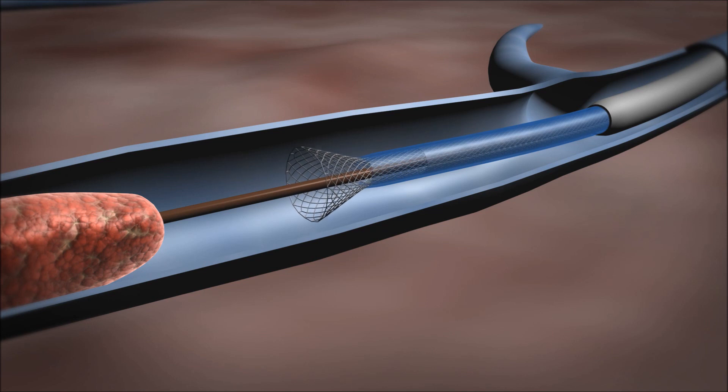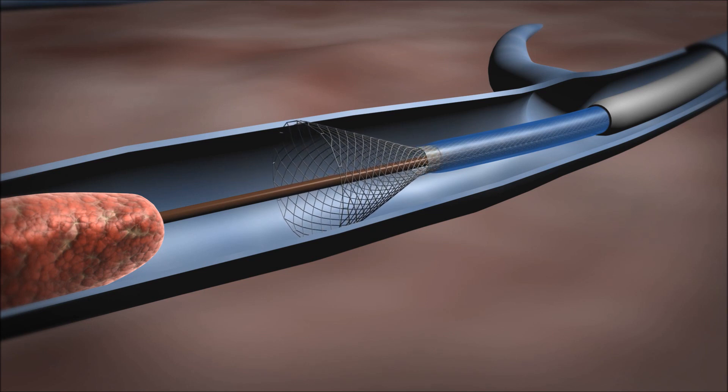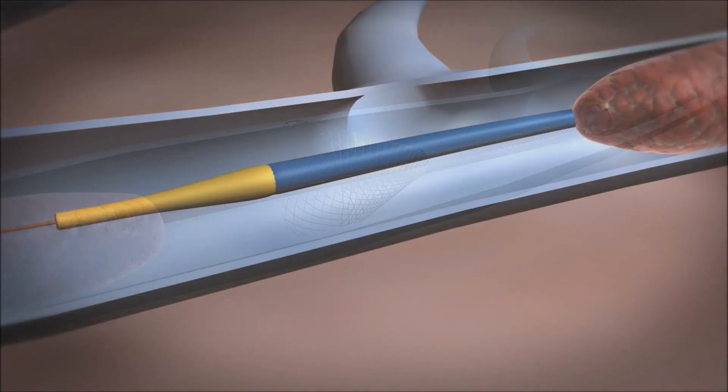The funnel sheath is retracted to deploy the self-expanding funnel, which provides proximal embolic protection and is used to guide the clot removal.